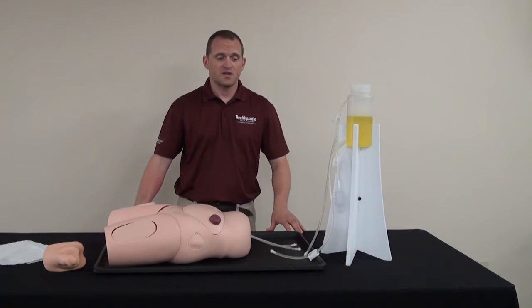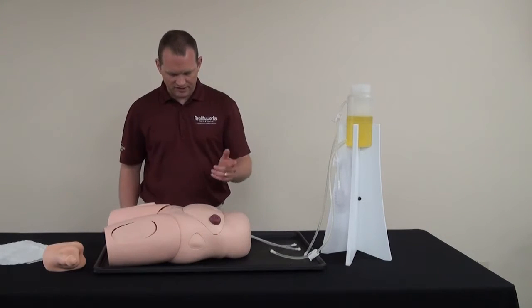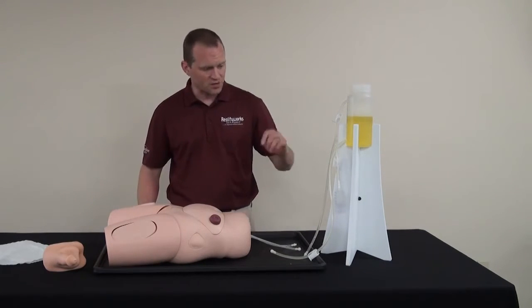Hello, I'm Nate, your product support specialist at RealityWorks. I'm going to show you how to attach the vinyl catheterization model to the fast fluid tower.